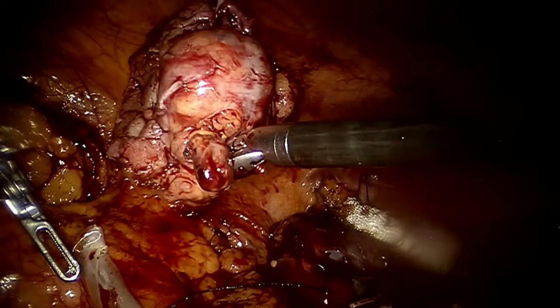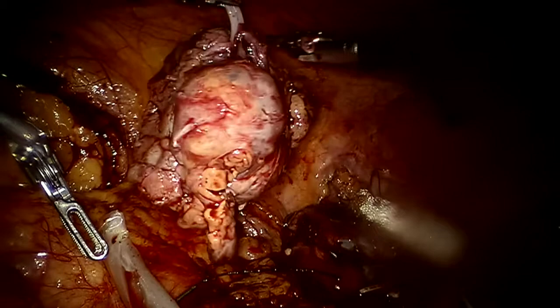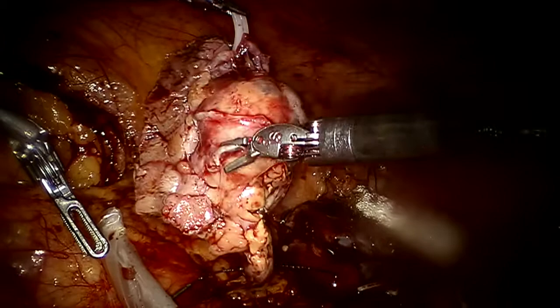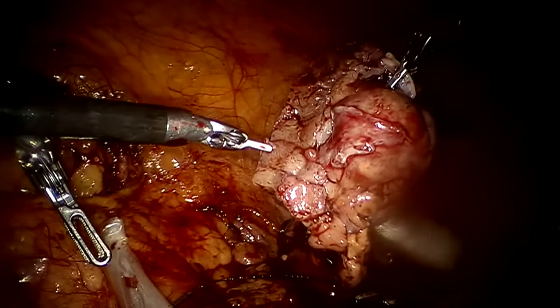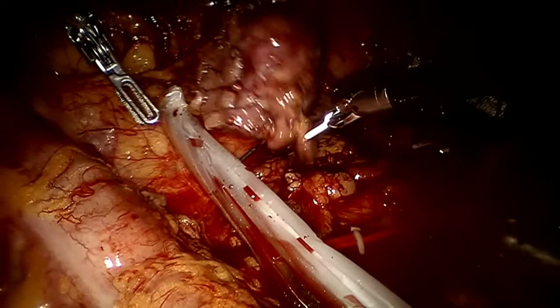So, Vincenzo, look at this. So, this is the thrombus. See that? That's the thrombus right there. And this is the entire tumor which was touching the central sinus. And we have intact capsule. This here is the collecting system on the tumor. I like it. Over here looks good. So literally the only parenchyma he has lost is right on top of the tumor. But other than that, we've sculpted it out pretty good. And so the parenchymal loss is this right here, plus whatever has been devascularized when we extracted it.